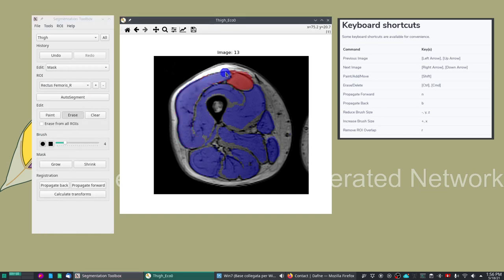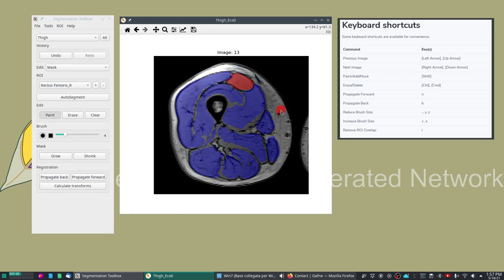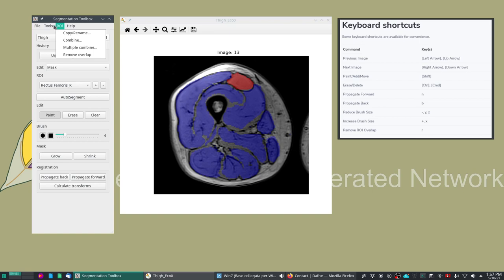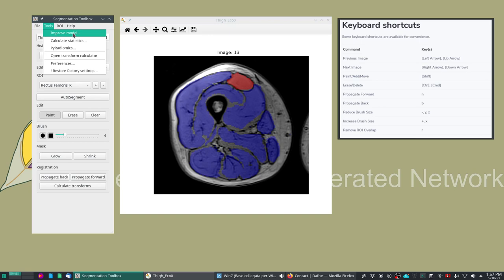Let's put it for example like this and clean it up a little bit. Initially you will need to do this operation for every muscle and every slice. When you have at least five slices that are satisfactorily segmented you can run an improve model step which will run an incremental learning step and improve the segmentation for future slices.